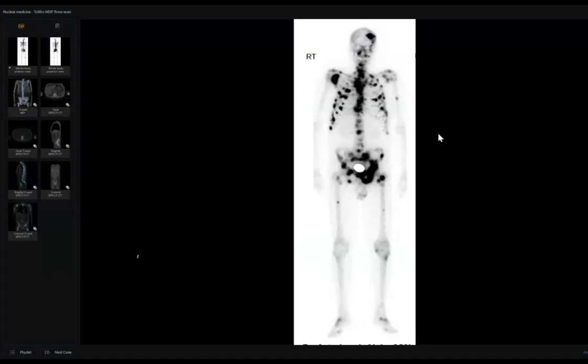These are sclerotic osteoblastic metastases, which increase the osteoblastic activity of the marrow cells rather than osteoclastic activity. Sure, the tumor secretes some substance that activates osteoblastic activity. That is a half answer, but I am asking specifically about this substance.